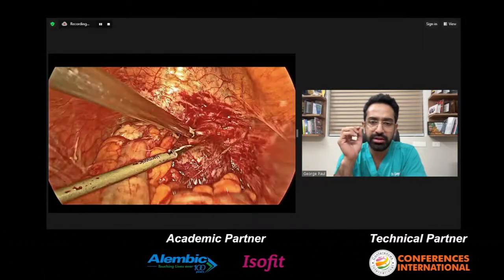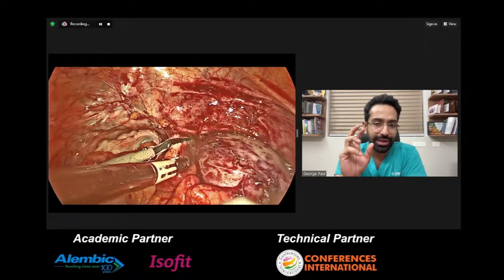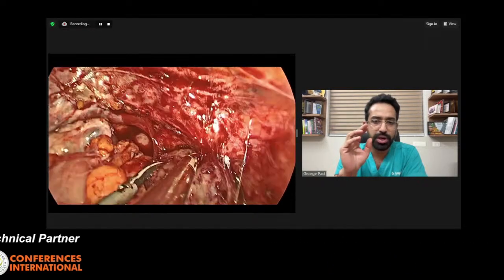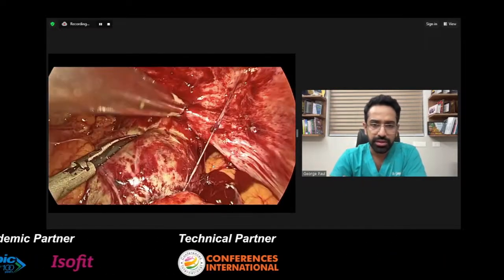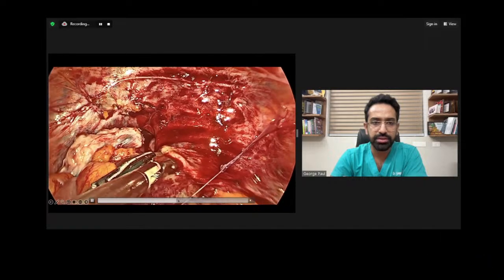So you have to be quite careful when you dissect, because it could have a very vascular pedicle to it. So when you're dissecting, use your bipolar, your harmonic. Don't just try to pull it out of the area where it is adherent. So this was relatively easy. We took out that piece.